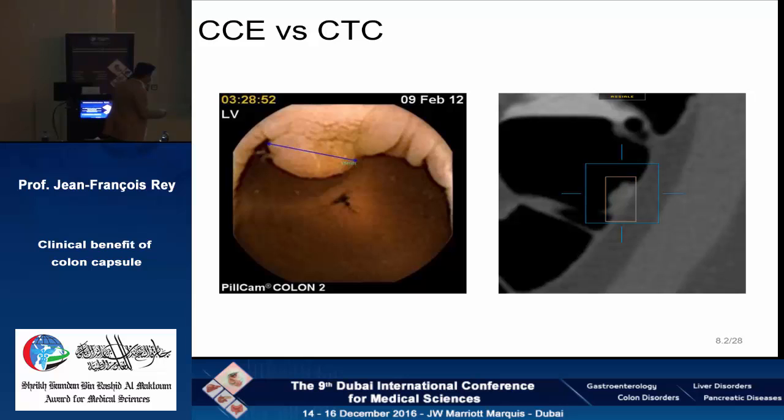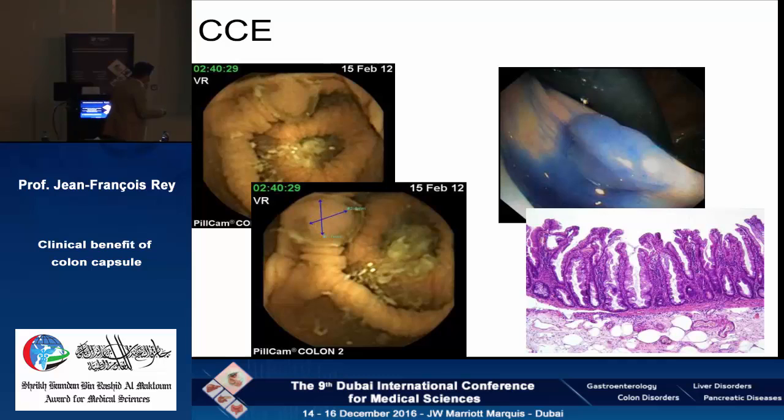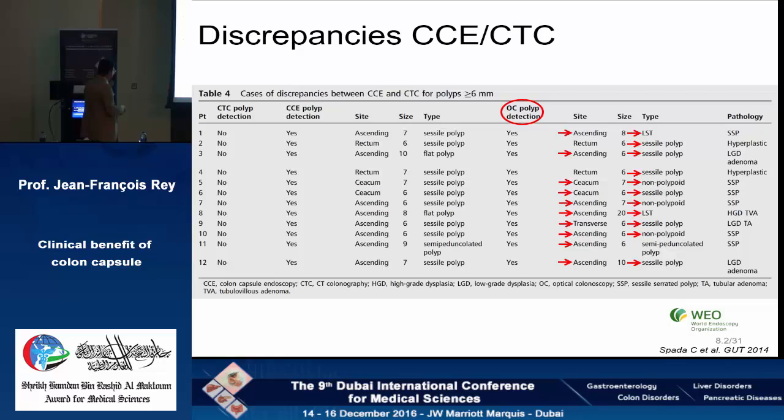you see, this is the result here. You could see this polyp and this polyp in CT colonography. And again, the difficulty of this diagnosis, and it was this lesion. But in some cases like that, it's very, very difficult to assess this small lesion with a capsule. So the overall differences in the detection, of the cecum, non-polyp, the overall result of this very busy slide, is that colon capsule is better than CT colonography. That is very clear from this publication.